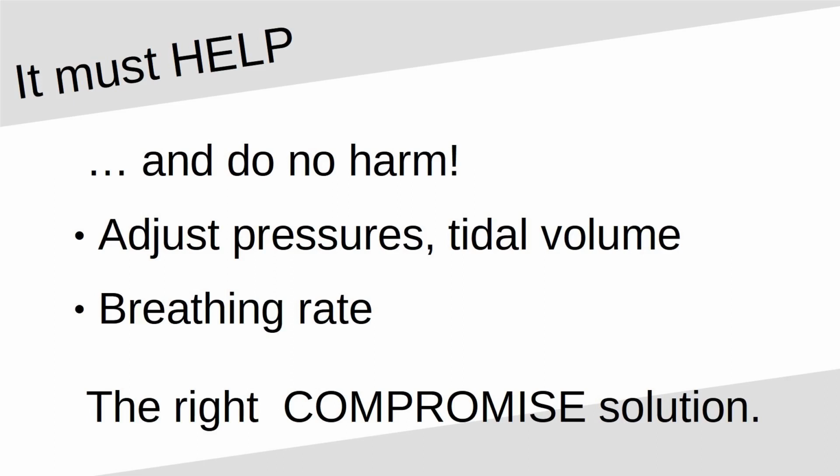Modern ventilators apparently have all sorts of sensors that can sense when the person is trying to breathe, and if so, then the ventilator helps them. The simpler ventilators that we're working on right now, taking inspiration from some of the first ventilators in the 1950s or 60s, just have a set breathing rate, which is not nearly as good, but again may fall into the category of it's good enough.